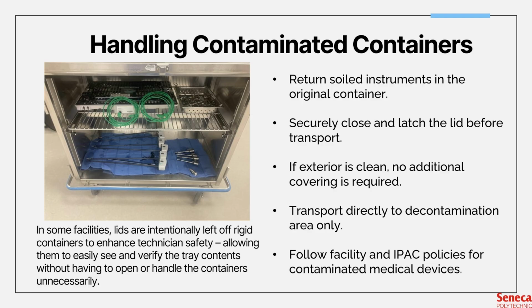And of course, your MDR decontamination workflow guidelines. With that said, though, in some facilities lids are actually left off containers after use for technician safety. This allows quick visual confirmation of contents and prevents unnecessary handling, especially if there are sharp instruments inside. It's best if the technician transporting it doesn't touch the contents inside as much as possible.